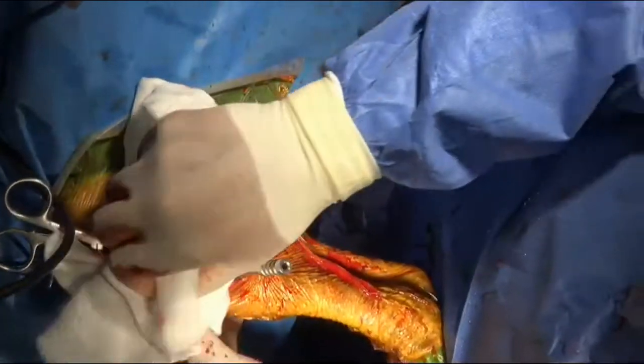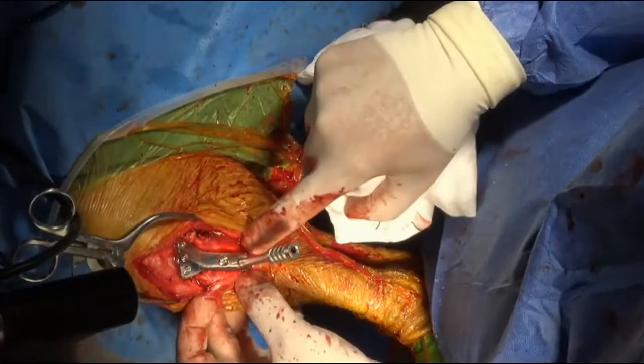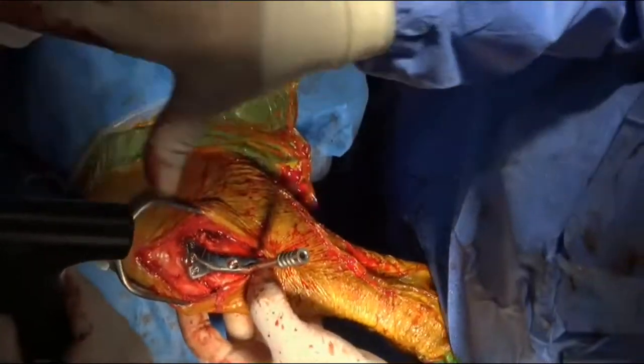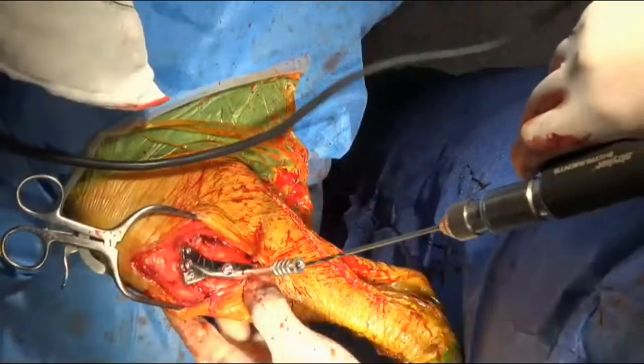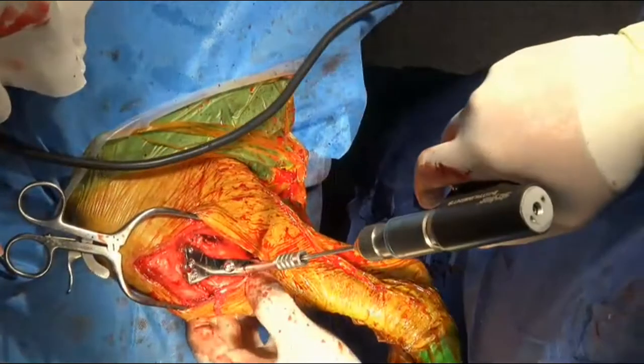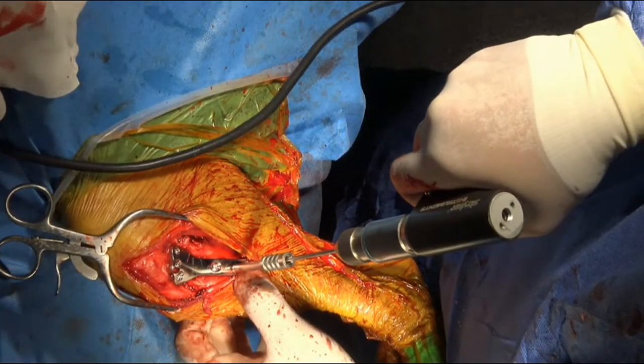I didn't even see that one there. Good eyes. Okay. And clean that bit of bone out of there. So a couple more screws to go and then we're done. Gonna leave it to you and Ari to finish up here.